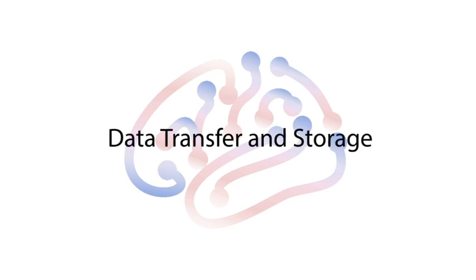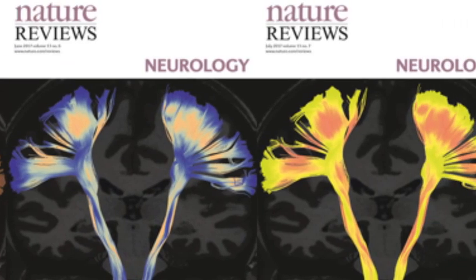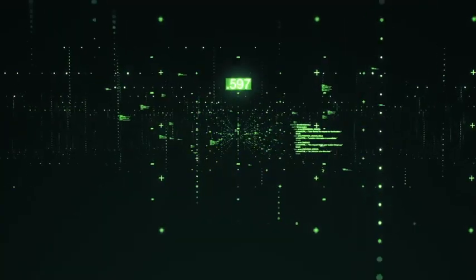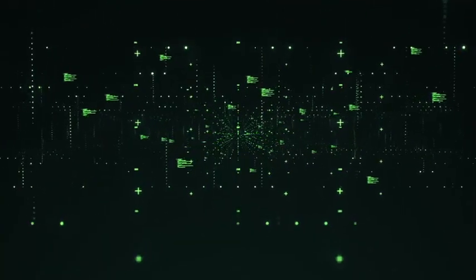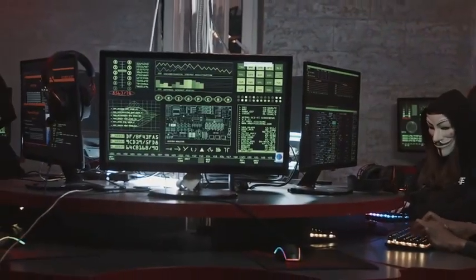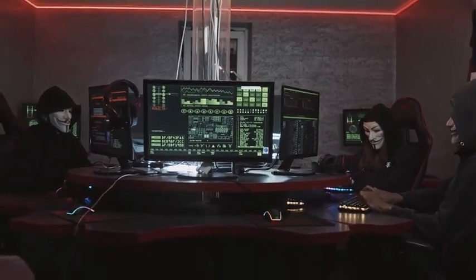First, diffusion MRI data are usually quite huge. Some scan data could be up to the size of gigabytes. However, the output of the pipeline, such as the tractography or connectivity matrix, are usually much smaller. Using cloud computing, you can keep data transfer on the cloud and save a lot of data transferring time. There is no need to store data locally just for processing. The pre-processing and analyses could be done on the cloud computers, and we only need to download the final results.